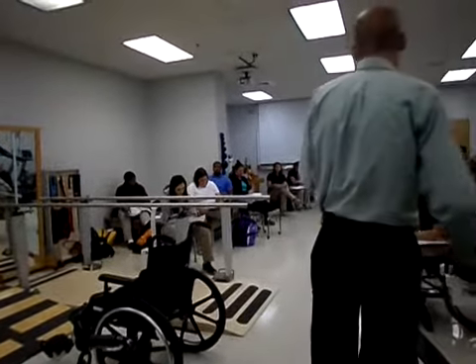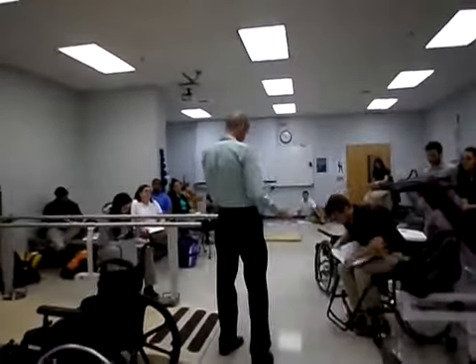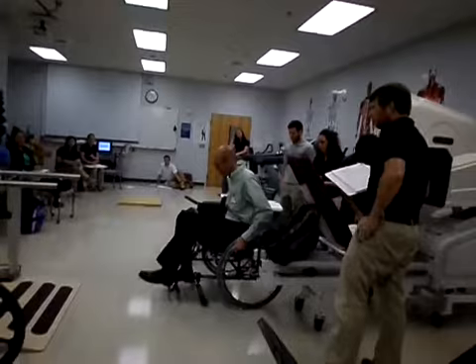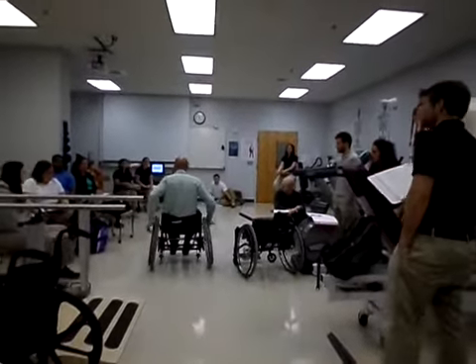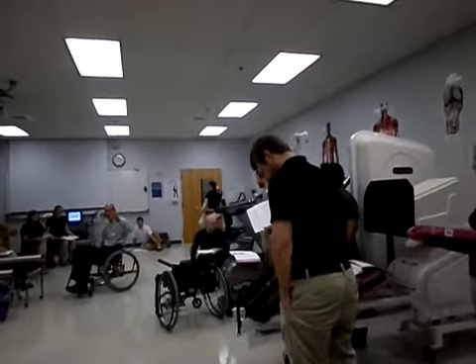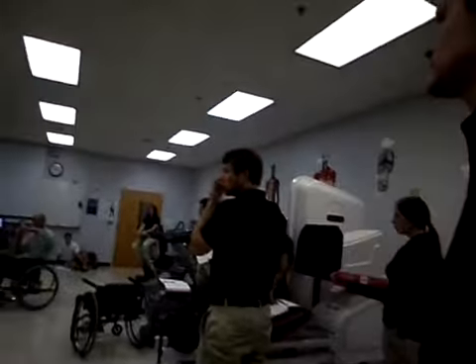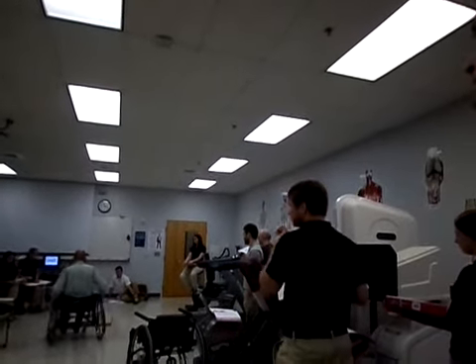All right, so independent means you're in a wheelchair. Josh, I'll move that chair, please. So most of these will be easier on one of the sports chairs. Okay, so practicing going up and down a curb. This is not easy to do. Make sure someone's spotting you when you do it. It's very difficult to do on our higher curbs because they're at right angles, not like a real curb. So it's very hard to go up and down those steps. So I would just practice on the little curb here.